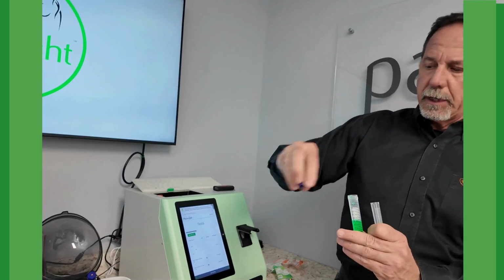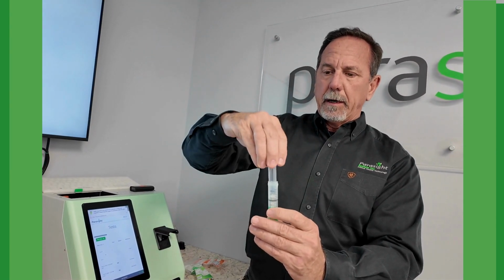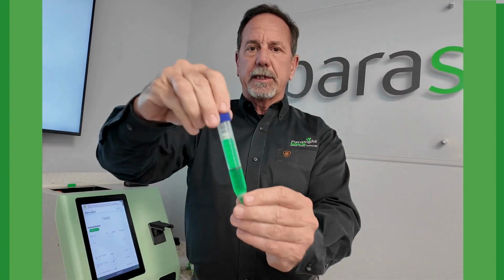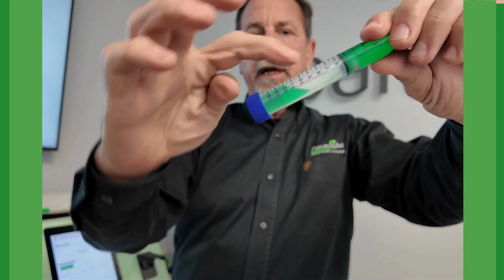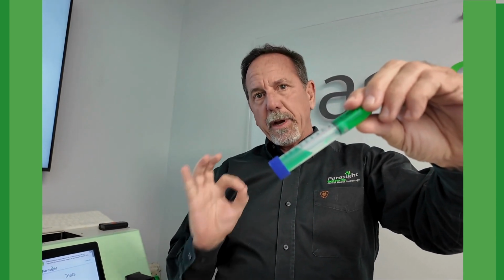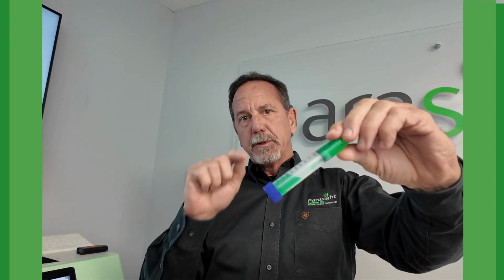What you're going to do is open that up, and remember, we ask you to gently put the egg separator in there. Push down on that. Lock that out, and you'll notice something, and this is very key. If you've done this, if we try to pour it out, you'll see it only pours out that much liquid. If you are ever overflowing your egg chamber, that means you forgot to put in the egg separator, because it's impossible to overflow the chamber if you put in an egg separator.